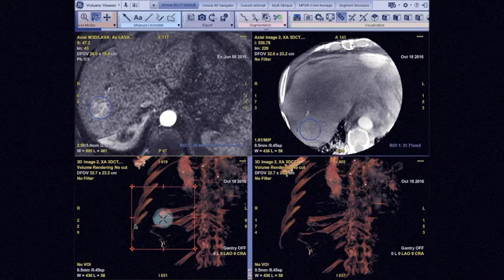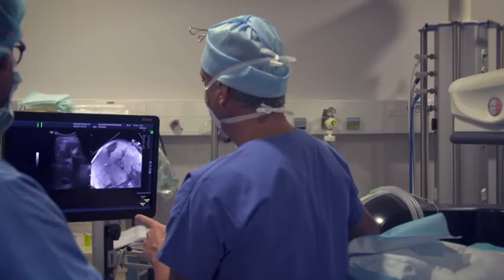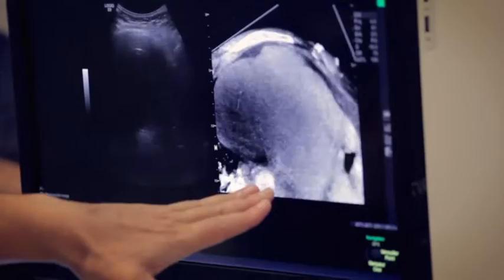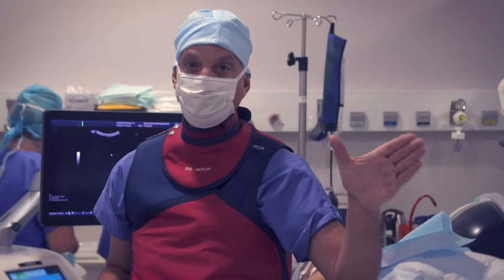We can then display the sphere on the fluoroscopy to control the relative position of the electrodes with respect to the tumor. With no action on my part, the system recognized on its own and performed this re-recording of both volumes. Here is the cone beam CT — the reference image — with the arterial acquisition that we can clearly observe.